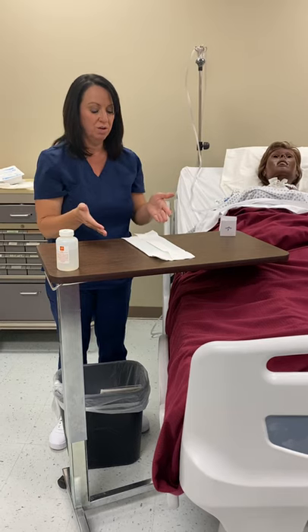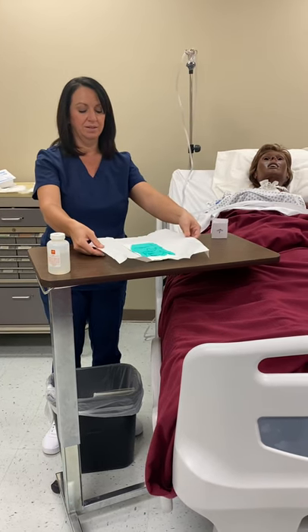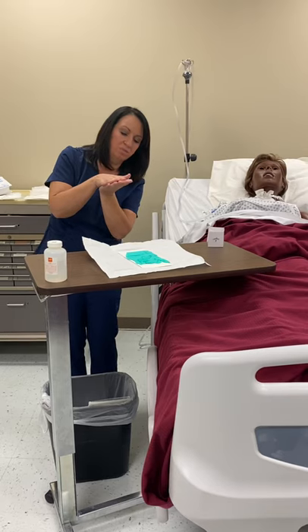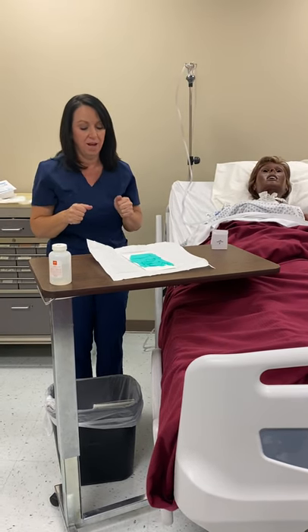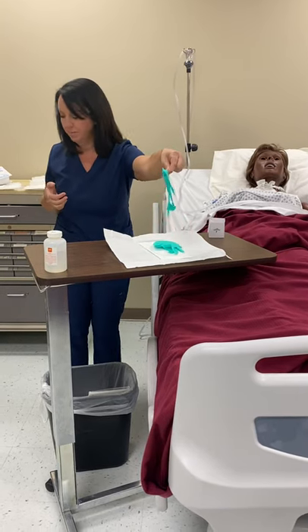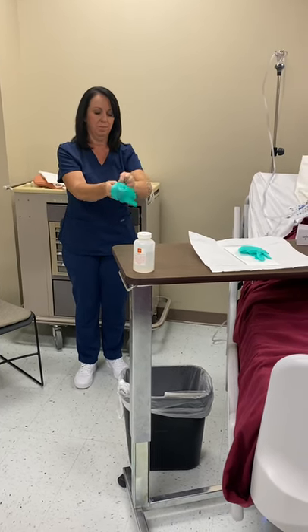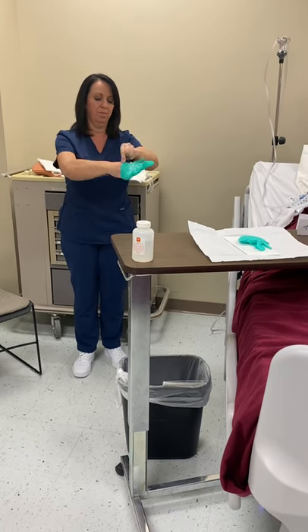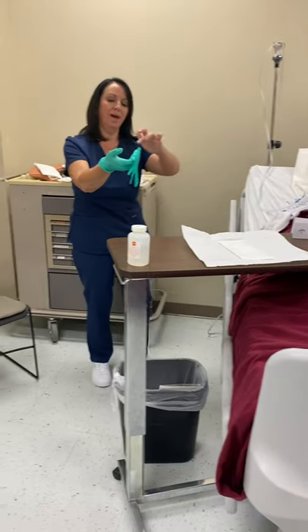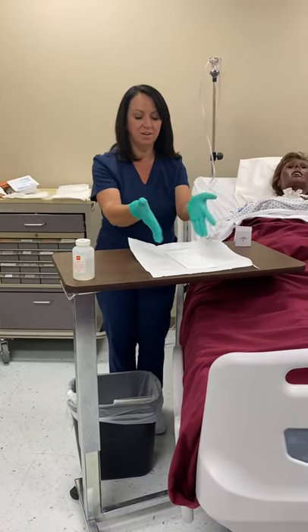This is just like with the sterile gloves where you have the little flaps. I've got my flaps and I'm going to pull it tight — I don't want it to flap back on itself. I can see my gloves are packaged one on top of the other, and usually it's the right-handed glove that's on top. I'm going to do just like I do with sterile gloves: I'm going to pinch the first glove and step back, going palm up. I'm going to scoop the second glove and step back with it. Now I can touch everything on my catheter.